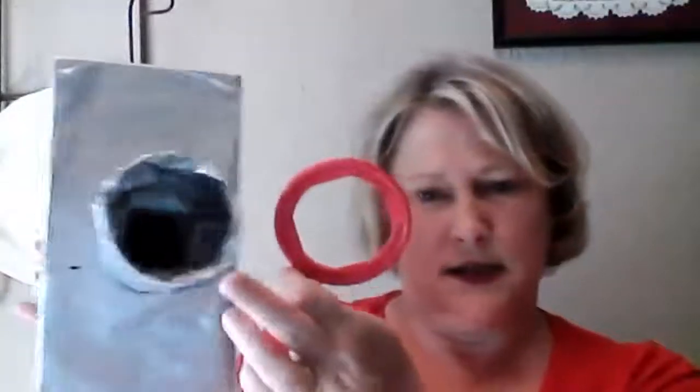I don't know if y'all can see. Can y'all see my ring? Can y'all see my PID? So whenever you're taking an x-ray, you will always put the cone directly on the ring. If it was like that, is the cone directly on the ring?